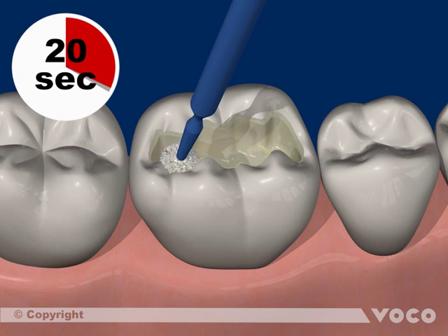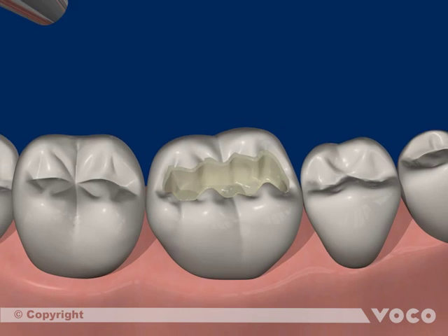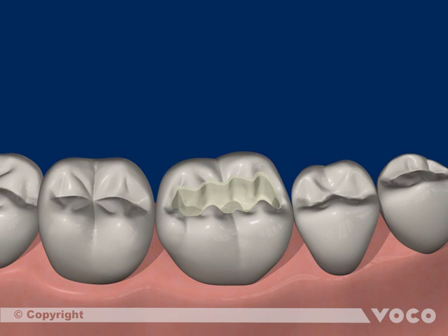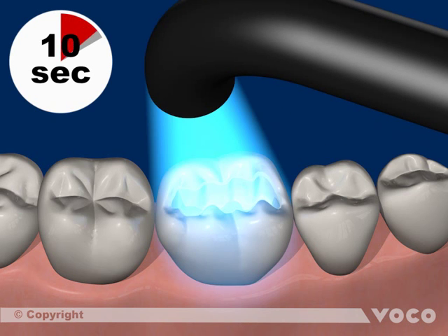The adhesive layer is dried with dry oil-free air for 5 seconds to remove any solvents. Finally, the material is light cured for 10 seconds.